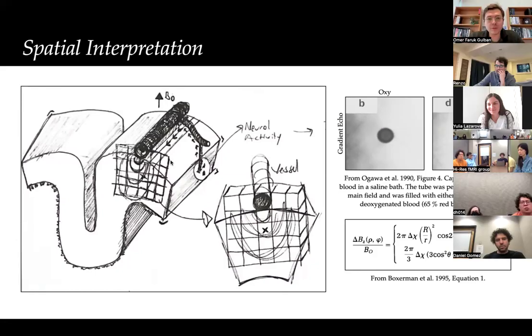So basically what you should imagine is this: there's this pial vein up here. By itself it exerts a magnetic field distortion outside of itself, which I try to indicate here with these distortion isodistant lines. These are distortions in the magnetic field, or susceptibility changes, whatever you want to call it. And realize that this pial vein here is perpendicular to B0, the main magnetic field.